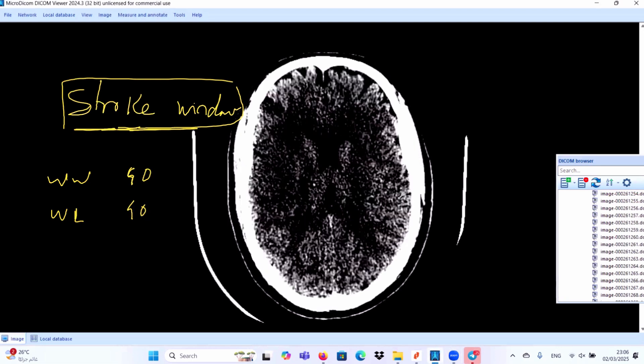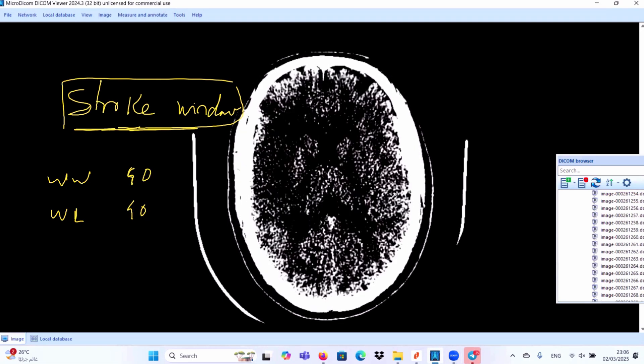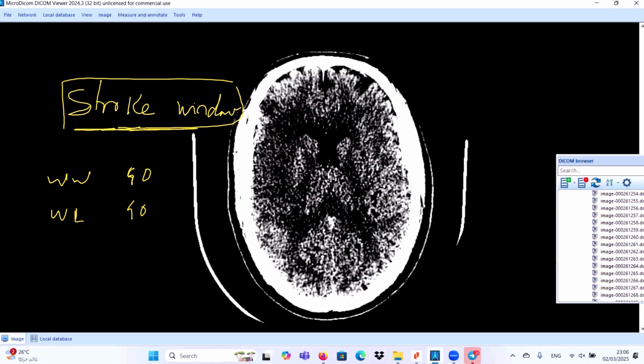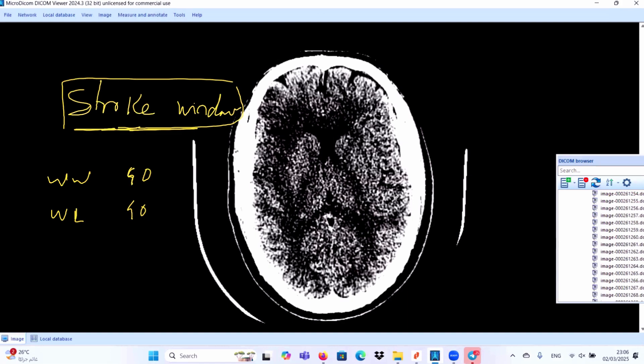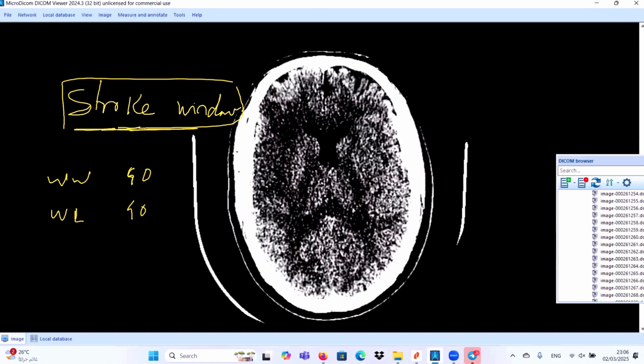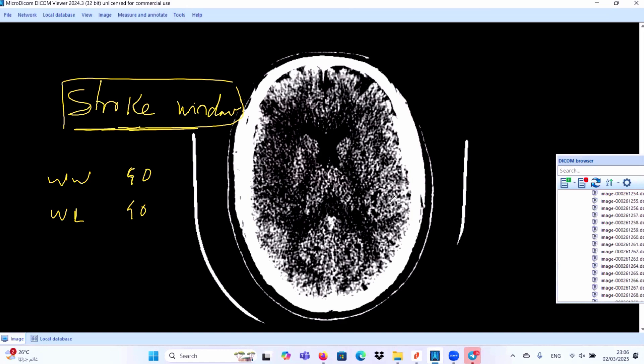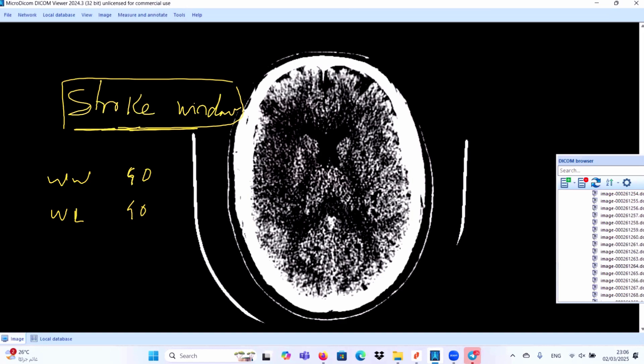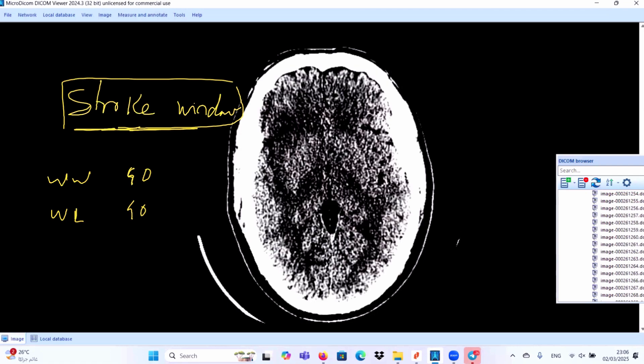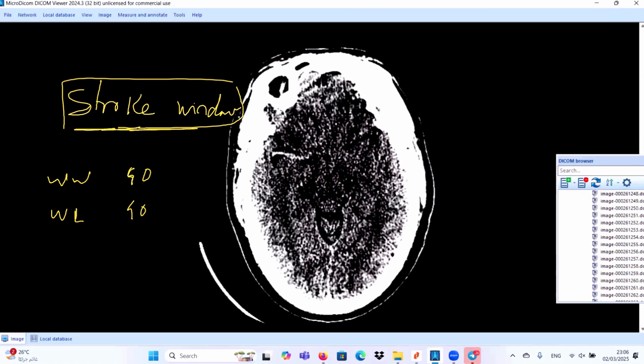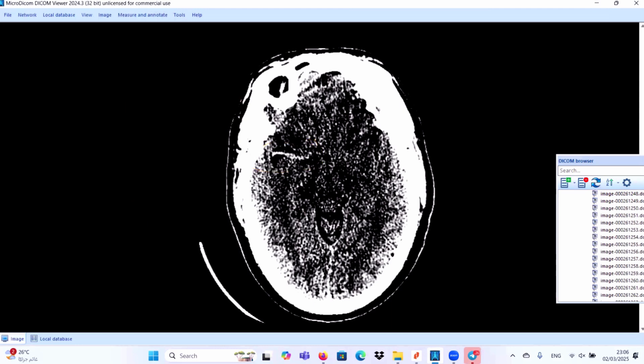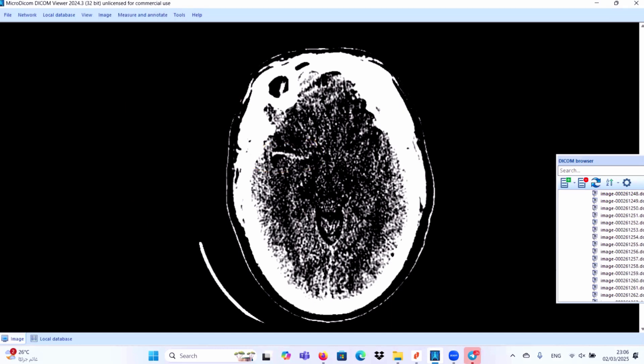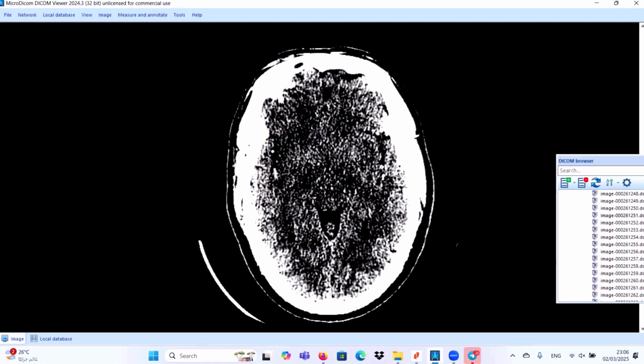This is a stroke window. In the stroke window, first you will confirm the right middle cerebral artery sign. This sign is more obvious now in the stroke window as compared to the contralateral side. Also, the insular part is more obvious.